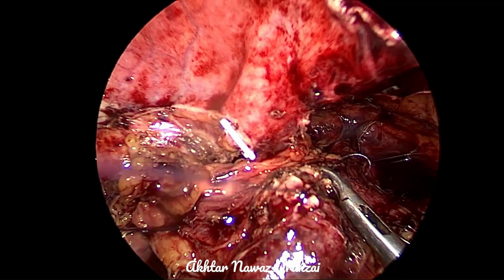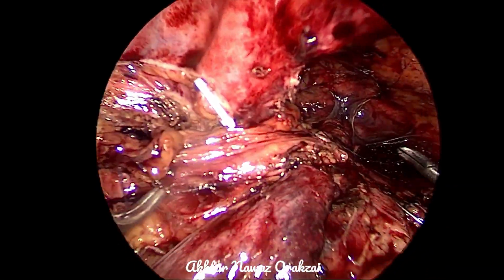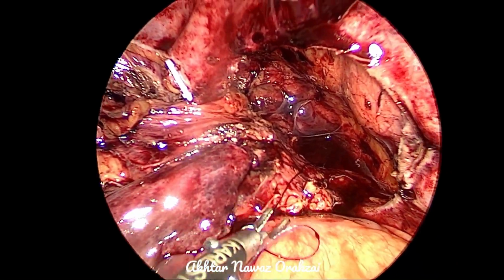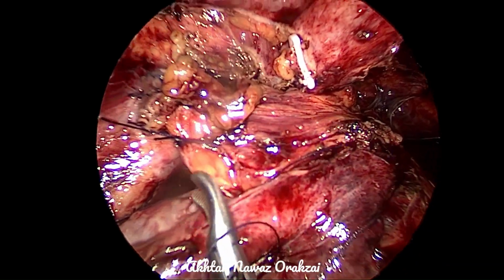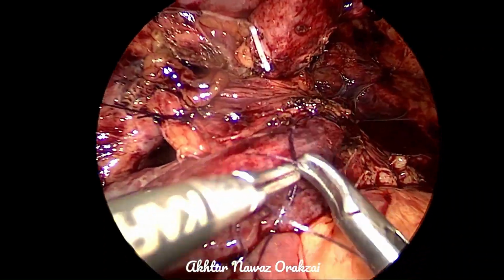So the ureter is then buried in the submucosal tunnel. Use the anti-reflux surgery. As I mentioned earlier in the procedure, it is not usually needed in adults, especially in females who have low pressure bladders.